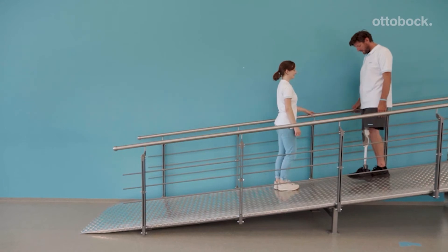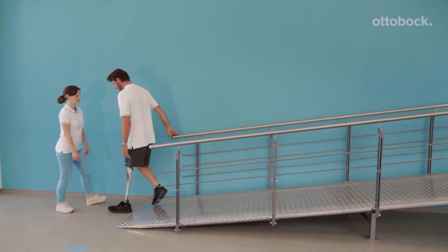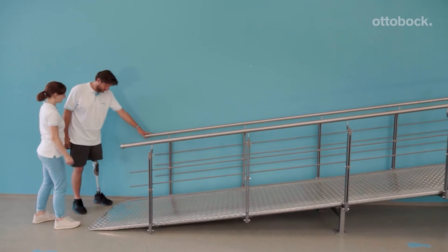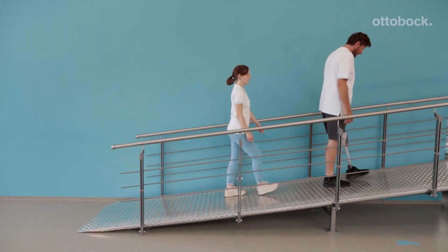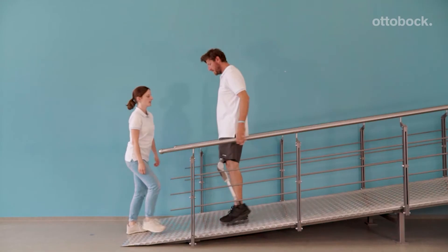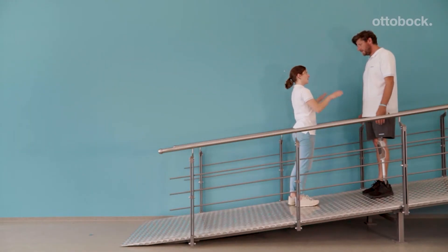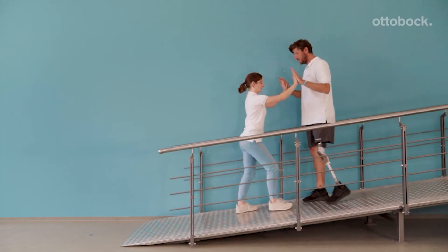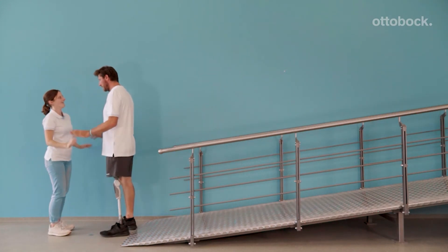When our model is confident enough, he should practice going down the ramp without assist, and the therapist can correct as necessary. Change the side of the handrail as confidence increases. The steps should not be too big, as the model might go too fast and risk a fall. An adjustment of stance flexion resistance might be necessary by the CPO.